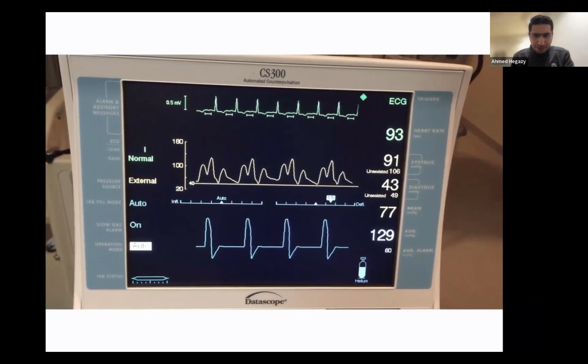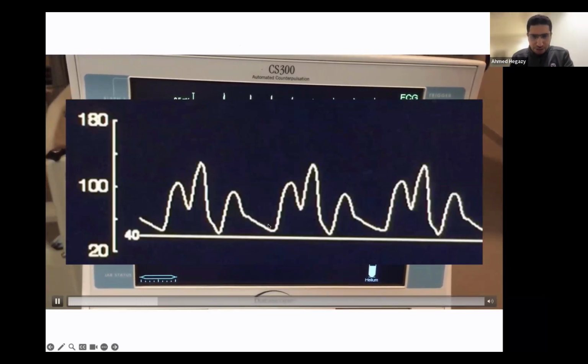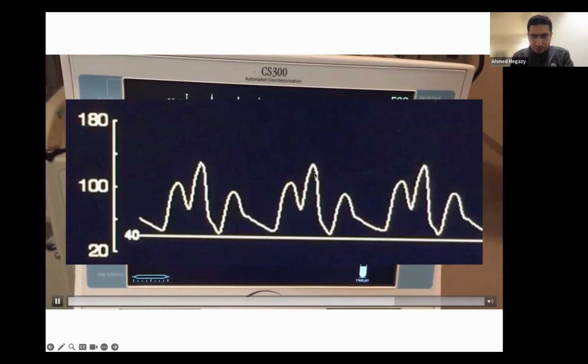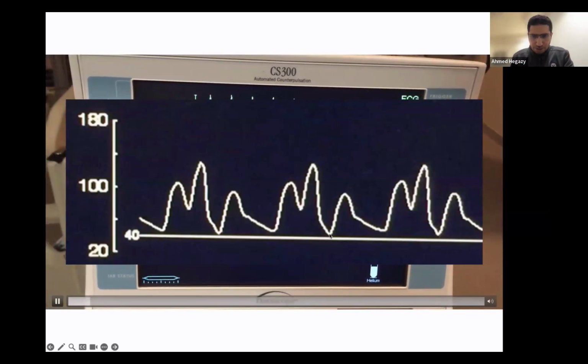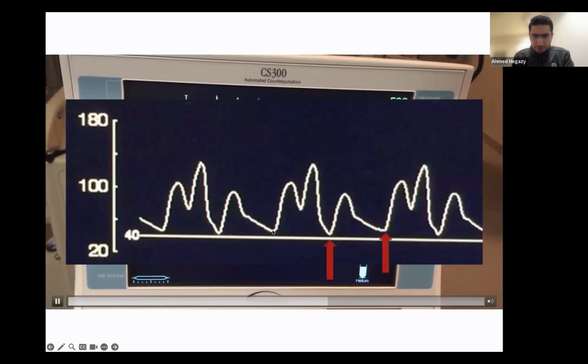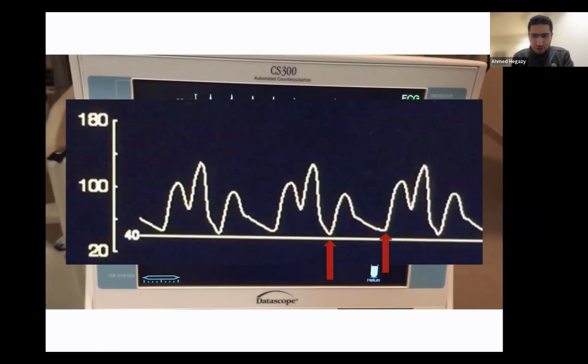Let's look at the aortic end diastolic pressure. So here we've used a reference line to see what the aortic end diastolic pressure looks like. So here, right after deflation, there's an aortic end diastolic pressure that is lower than your native diastolic pressure. So let's look at these here. You see an aortic end diastolic that is actually lower than your native diastolic. So that's parameter number 2. That tells me the balloon pump is working well. I put it 1 to 2. I used my reference line. I looked at the aortic end diastolic pressure right after augmentation, and it's lower than my native diastolic pressure.